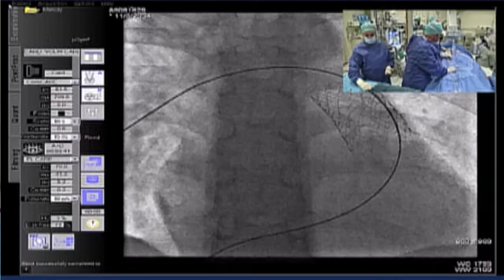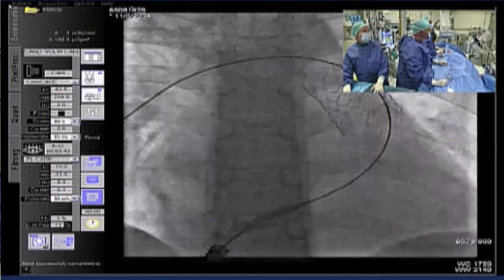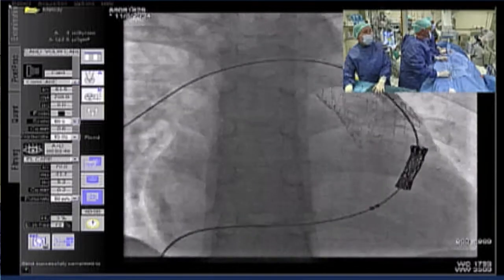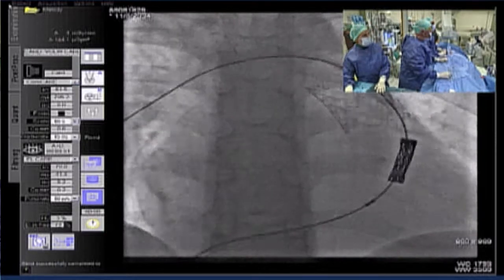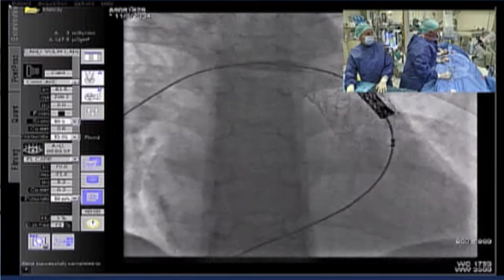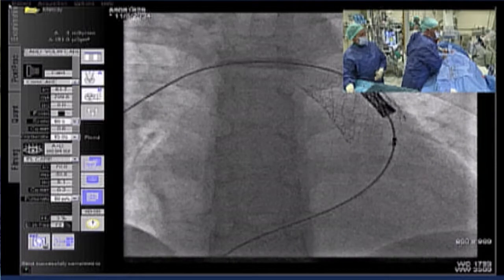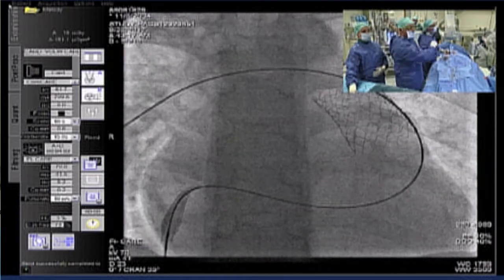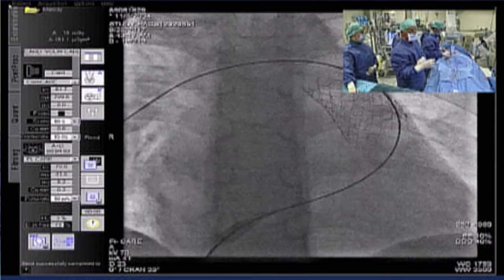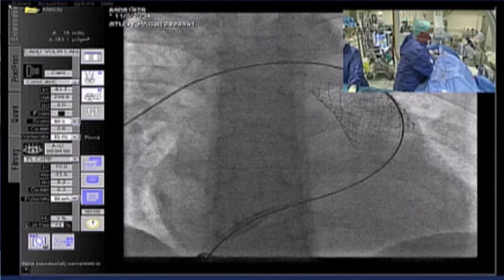Okay, valve comes in. Valve comes in. Okay. So we go in. Can we move the box, please? See, the melody is slightly anterior. It goes very nicely, but the melody is anterior. Can you show the picture on the left side? Can you tell the photographer to remove that box and show us the lateral? This is the lateral, but my melody valve is too anterior on the balloon.